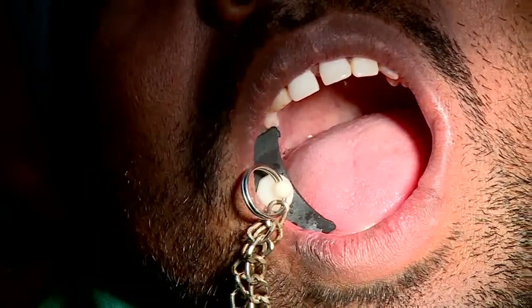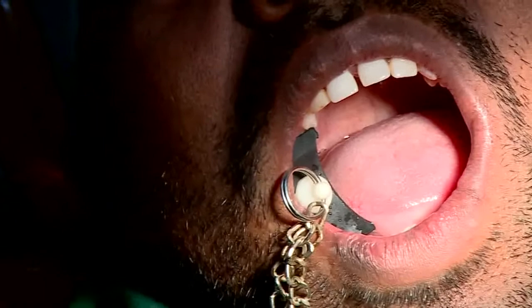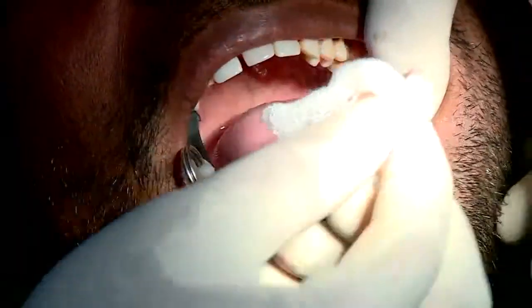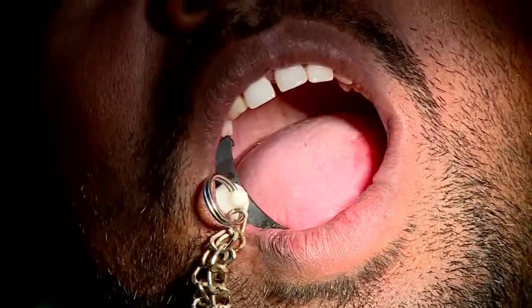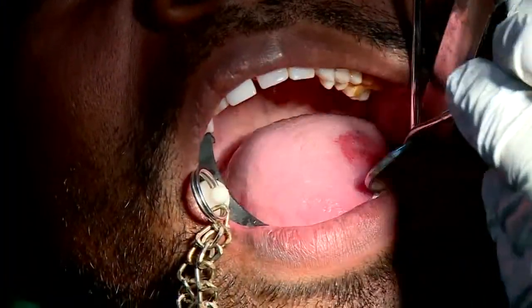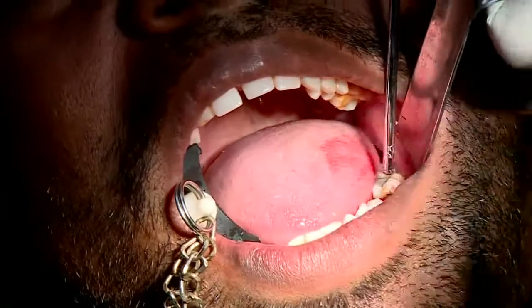Yes, and they'll be able to know the exact occlusal contacts. Yes, and the same can be transferred as a surgical guide. I think that is how they would have done this guide also. In fact, they can show the models at the end of it. We will probably show the models at the end.